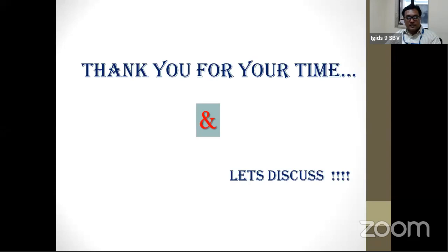Any other questions? Sir, it's me again, Surya Vamshi. What can be the minimum kVp and minimum milliamperes, or the maximum kVp and milliamperes, to get a CBCT image, sir? You see, every CBCT machine comes with its own parameters, right? So it's up to you to choose. It's not like an OPG machine. It depends on the exposure, the FOV that you select, and also the size and structure of the skeletal makeup of the patient. Depending on that, you will have to choose. There are no fixed parameters that I can really give you.